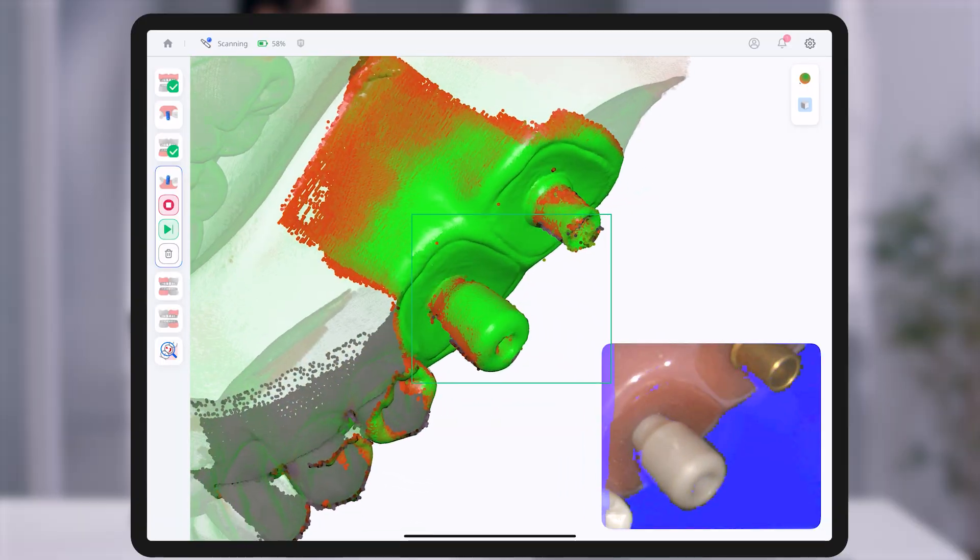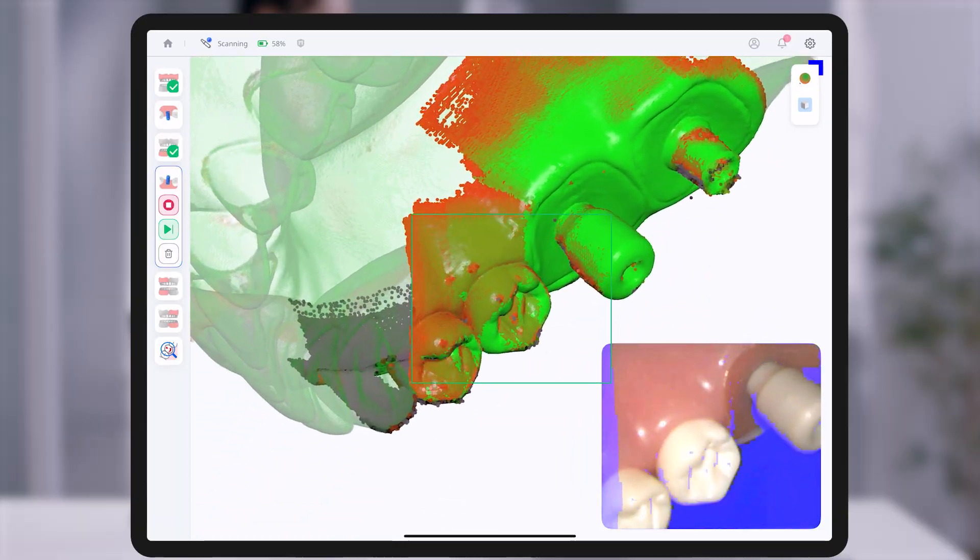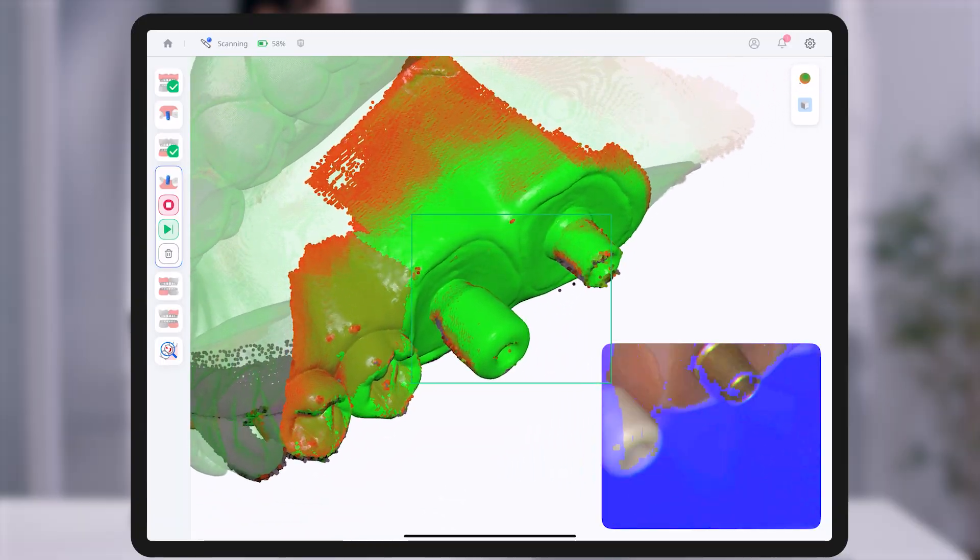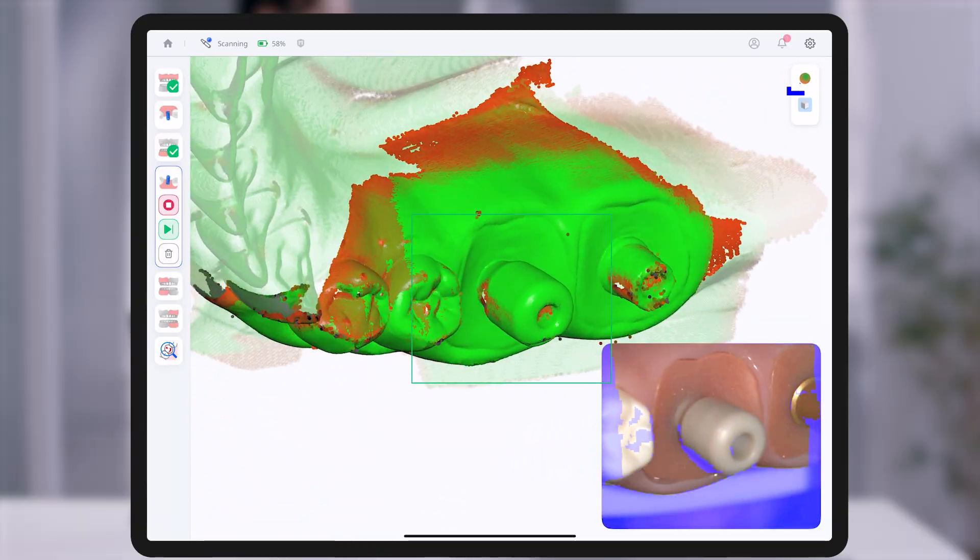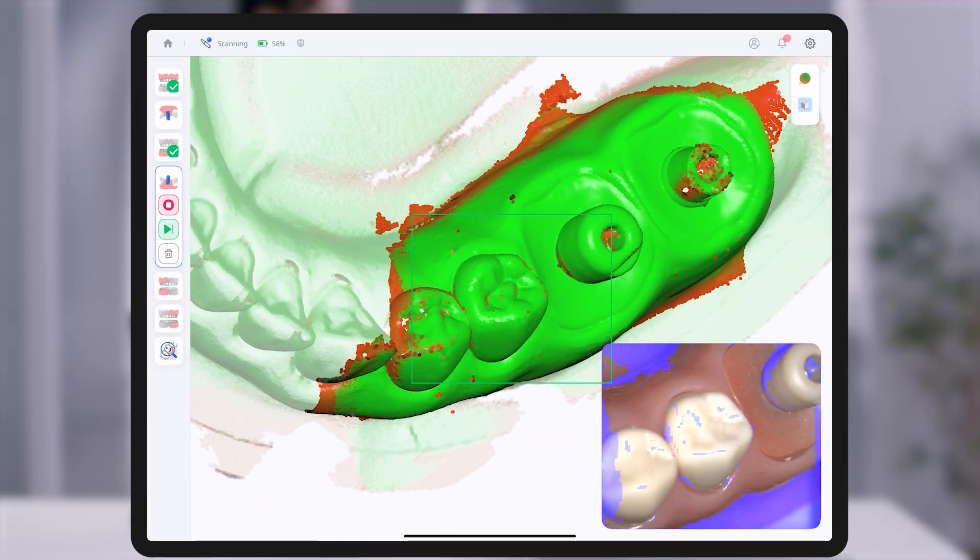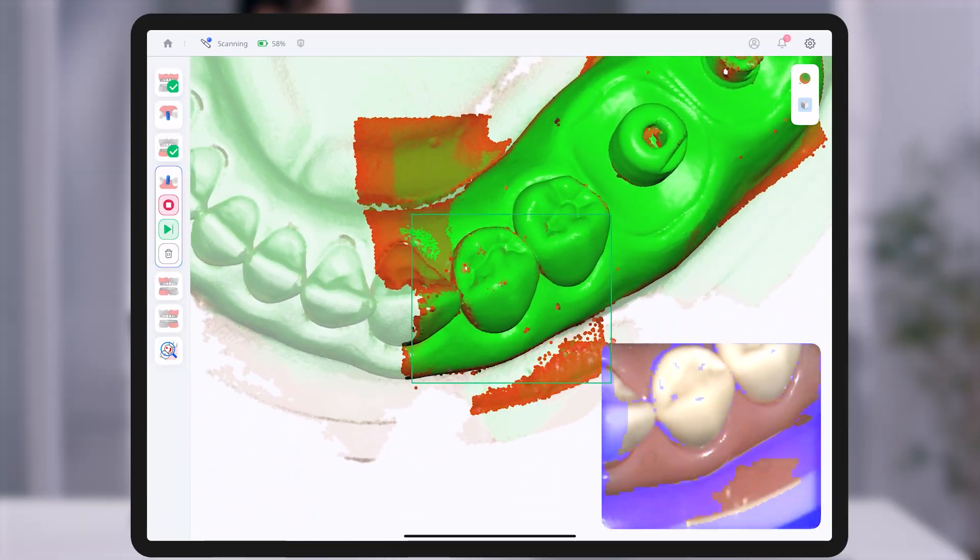This feature enables real-time identification and correction of insufficient areas, helping maintain optimal data quality and size.